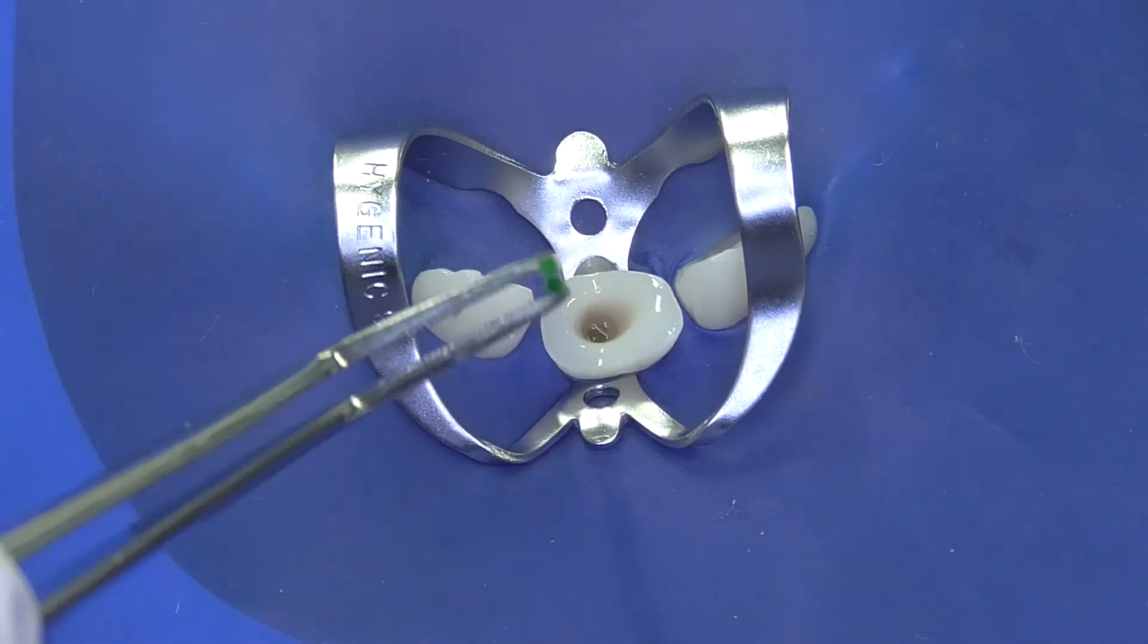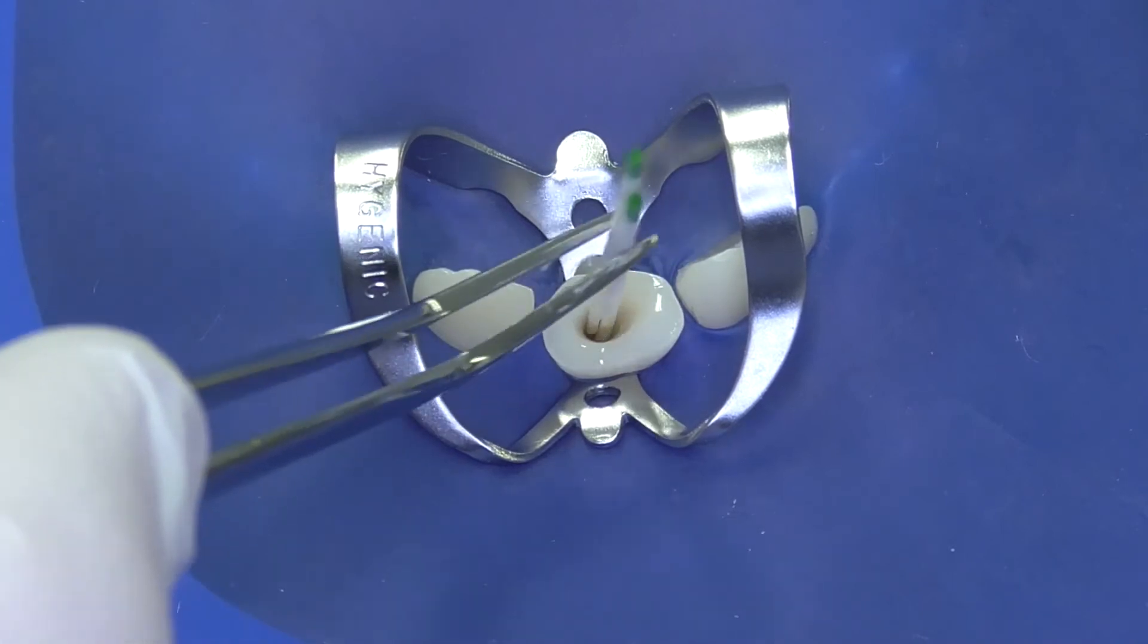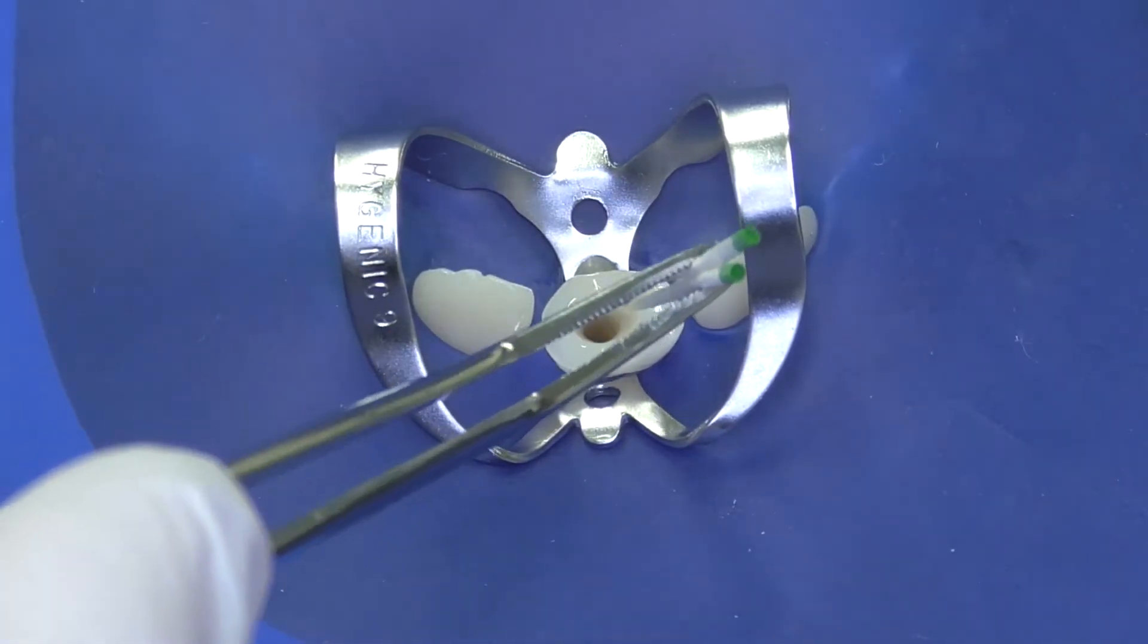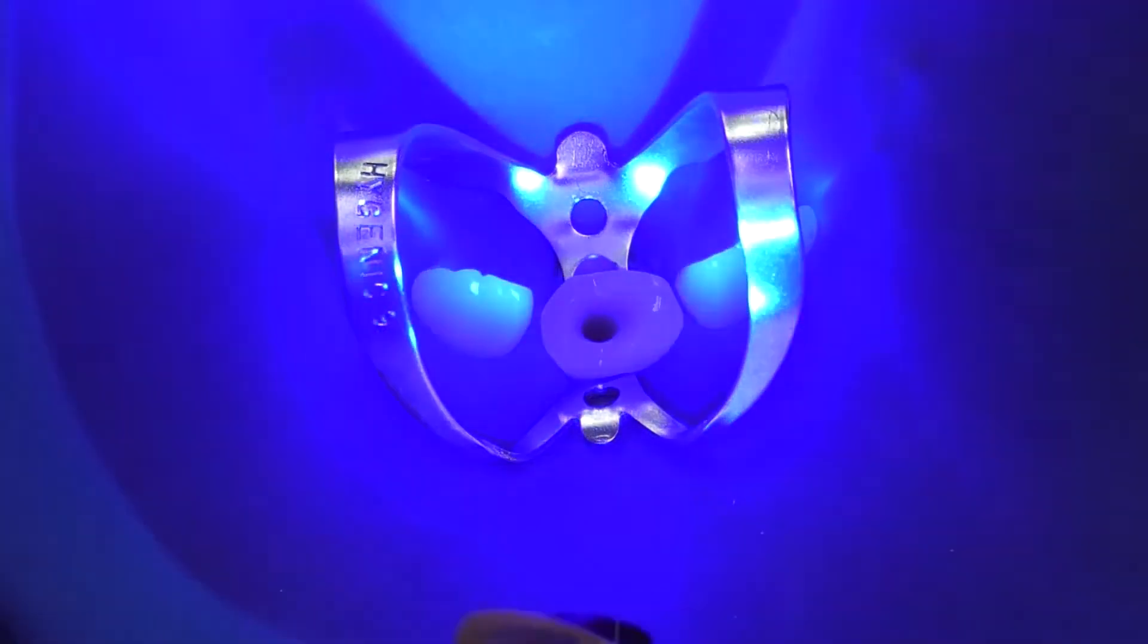Excess adhesive will be removed by paper points from the root canal. The adhesive will then be cured with light according to instructions of the adhesive.